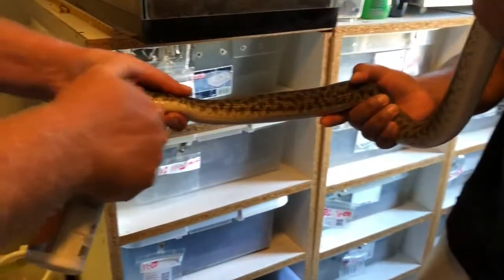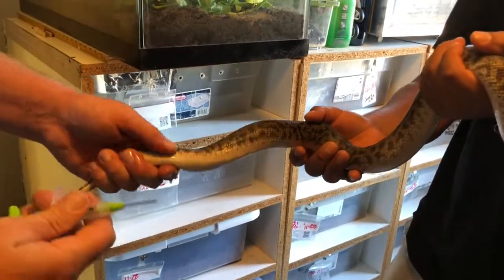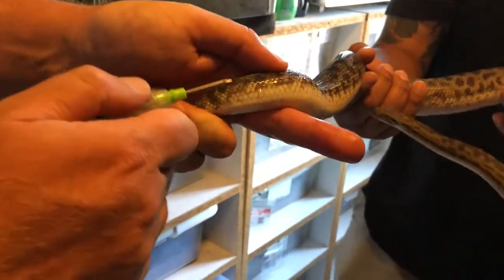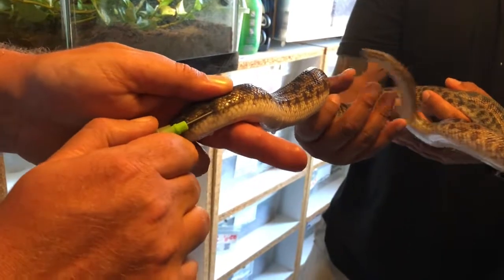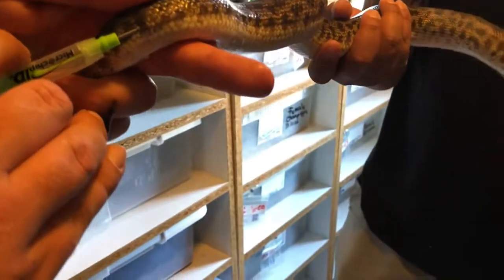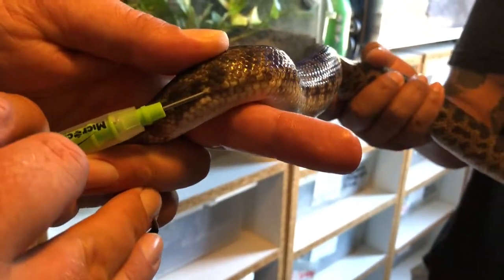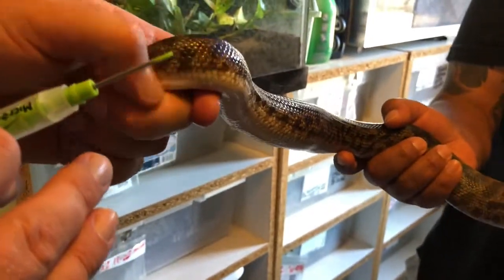Go about an inch and a half up from the cloaca, spray the heck out of it, come in from the side bevel up. We're gonna go through three layers of skin, stick the needle in right along it, push the needle in — and it popped. When it pops, that means the microchip is in there.